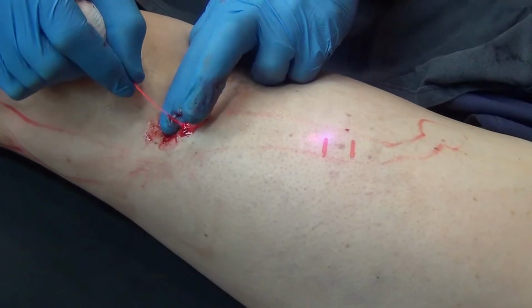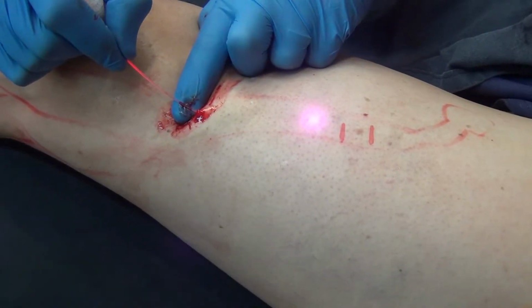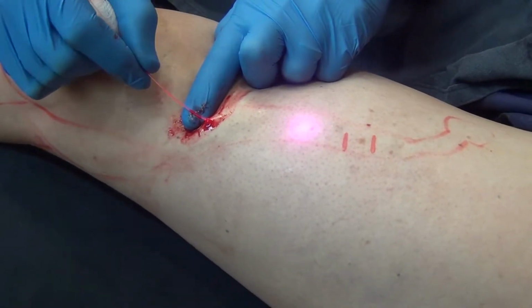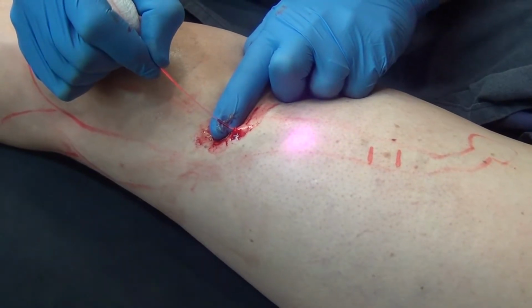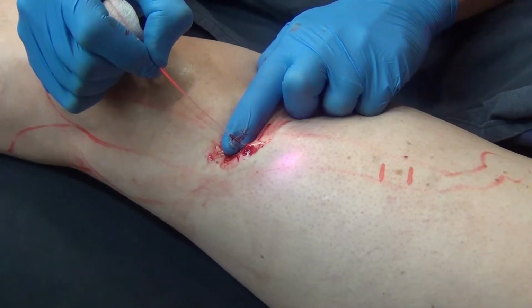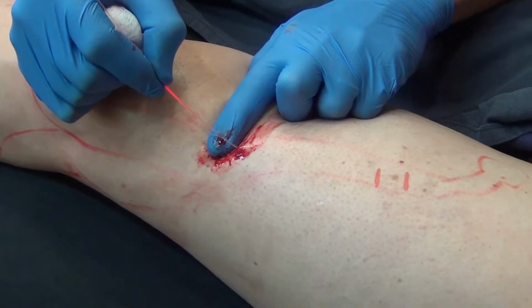What we're realizing here is a combination of endovascular laser ablation and the introduction of the STD foam, and this should close the varicose vein and its connection to the arteriole through the arteriovenous anomaly highly effectively.